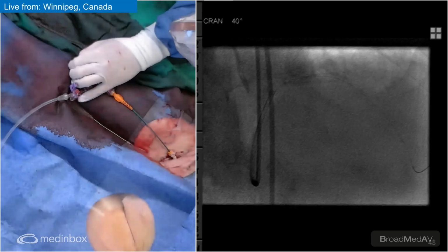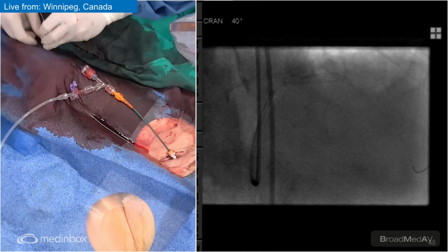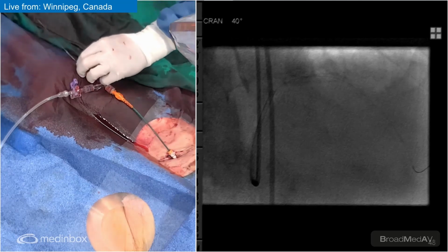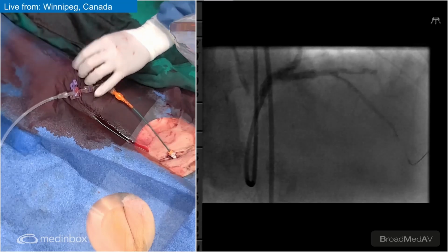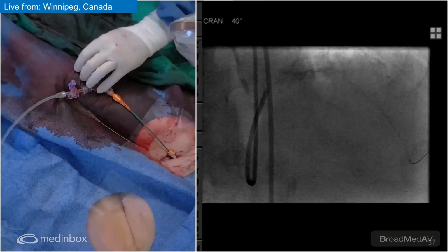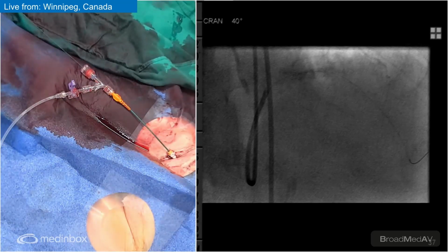The question that always comes up now is you've got a lesion there, you've got some recoil, post dilate or OCT again. Let's see. Puff there for me. Let's make sure we don't have any excitement anywhere else. That looks brilliant. I think it looks pretty good. I would say let's just do an OCT. Save contrast. Let's do an OCT. And then it takes the second guessing away from whether we have enough expansion of our stent. I have been fooled before, especially on single angle angios, to think that the stent is expanded.